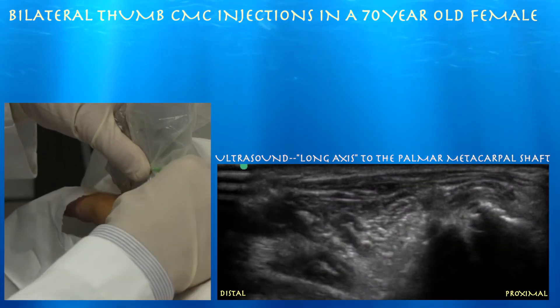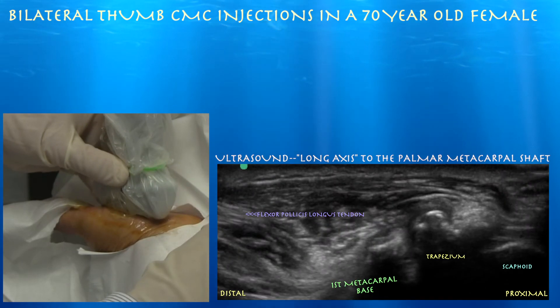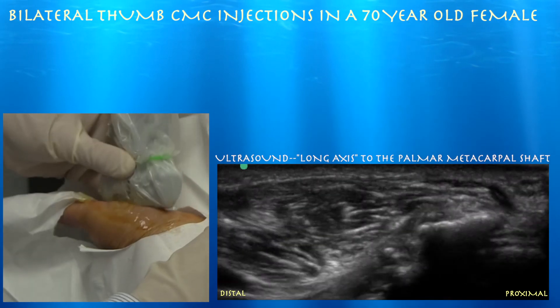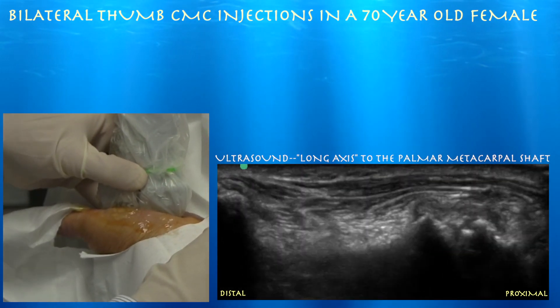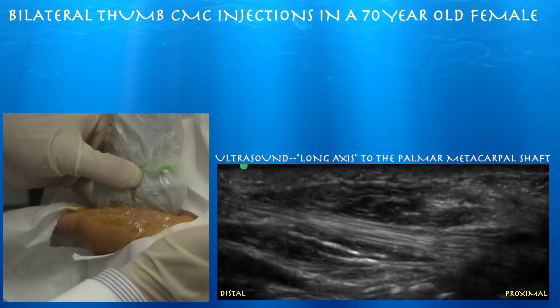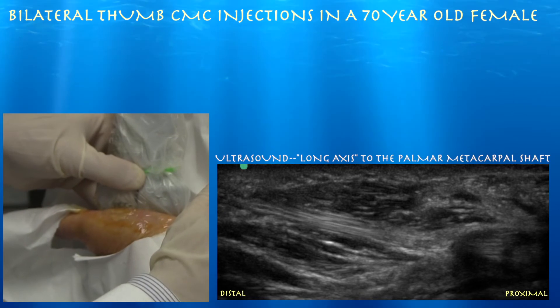So the question is, is it the thenar musculature? Here are some other structures — you can see the scaphoid all the way on the right side of the screen and a glimpse of the flexor pollicis longus tendon. Here's our tendon going across, and here's another view of the flexor pollicis longus tendon going all the way across.